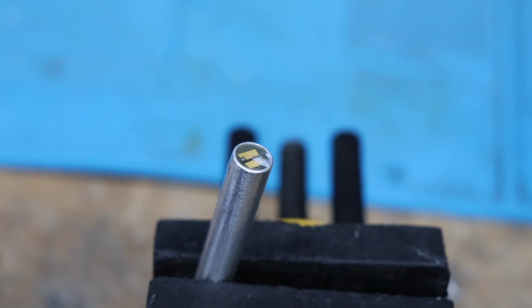probe is an 8.2 megahertz probe, and so those are ultrasonic waves. When that piezoelectric crystal vibrates, it's emitting ultrasonic waves at about 8 megahertz. You do get different frequencies. Just to give you an example, 8.2 megahertz or 8 megahertz is commonly used in vascular surgery for insonating blood vessels which are relatively close to the surface. If, for instance, you wanted to make up a Doppler machine for listening to a baby's heartbeat in pregnant ladies, then you wouldn't use this type of probe. The signal would get attenuated too quickly. So you go for a probe in the order of 2 megahertz. The fetal Doppler machines are usually around 2 megs.